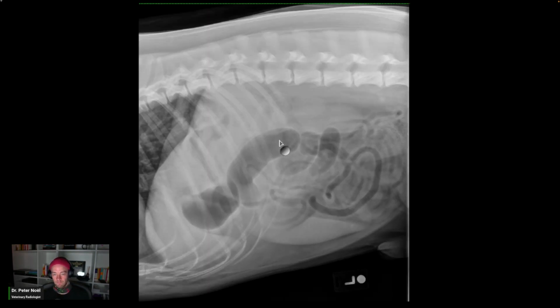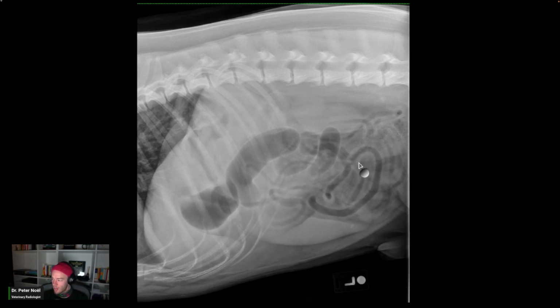So you look at the stomach, it's got a little bit of gas. The pylorus comes around like this, and then this is the duodenum right here. And then I lose it. Okay. So negative for a GI obstruction, probably gastroenteritis or gastroenterocolitis. Could be dietary intolerance, indiscretion, toxic, infectious or parasitic. Could be primary inflammatory, like inflammatory bowel disease, depending on chronicity.